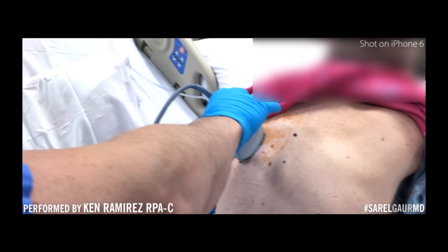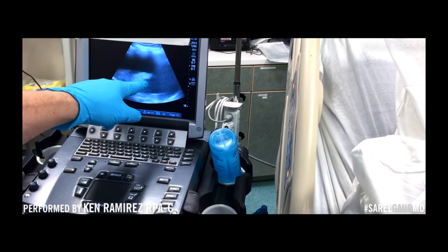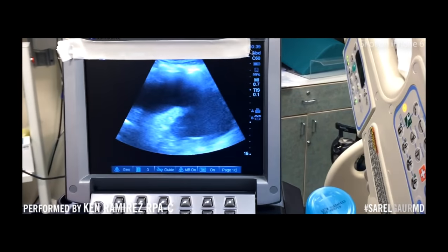There we see the lung — that white is the lung. And all this fluid, the black, is the fluid. All that black is the fluid.